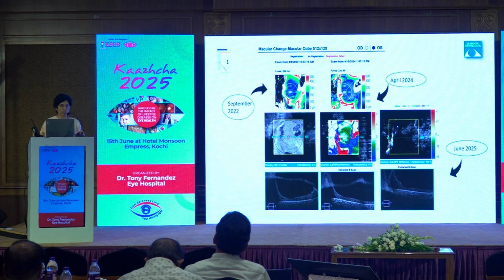Even the OCT is absolutely the same, like a Xerox copy. In September 2022 the macula is barely attached but still attached. This is April 2024, and this is now, June 2025. The macula is still attached, and the patient is maintaining vision of 6/24. So this is a situation where I would not advise surgery. This tractional retinal detachment has remained stable for nearly 3 years, and if you do not intervene, it may remain stable for many more years. By doing surgery, you are not going to help the patient.